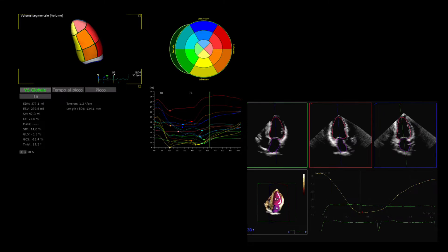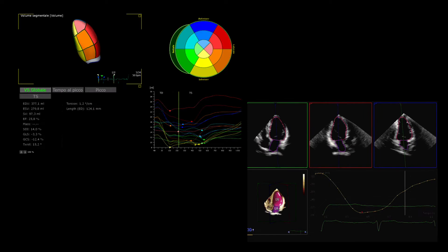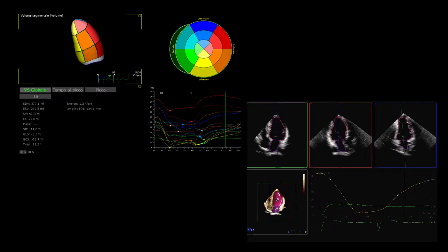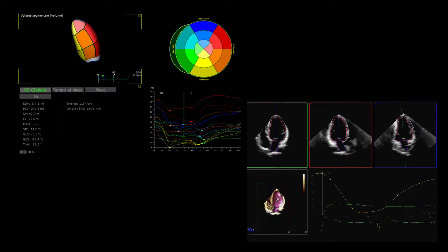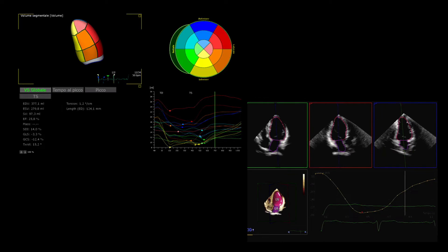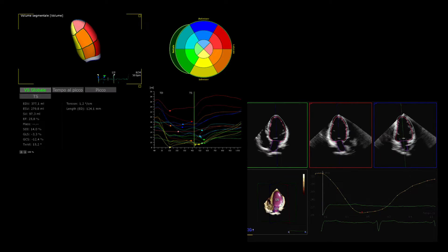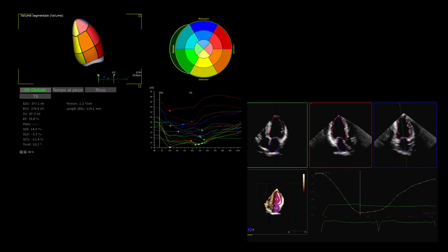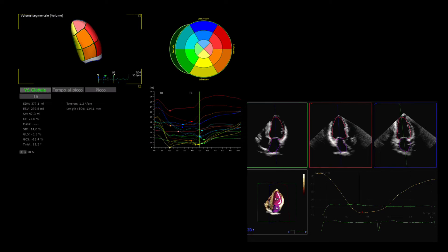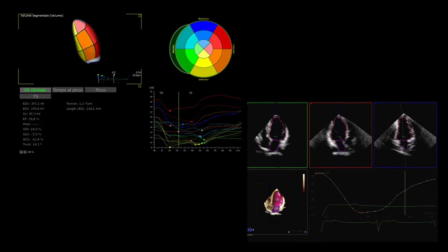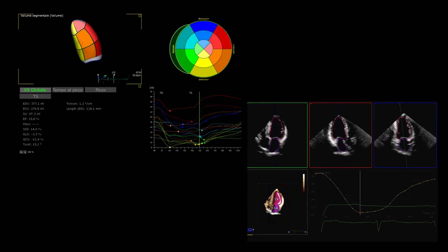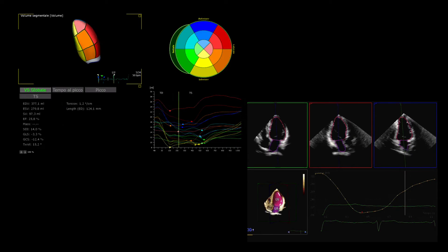Real-time 3D echocardiography is also a simple and reproducible method for measuring left ventricle dyssynchrony, free of the limitations of TDI. This technique is capable of capturing the 3D dynamics of the entire left ventricle, including the time of wall motion independent of its direction.